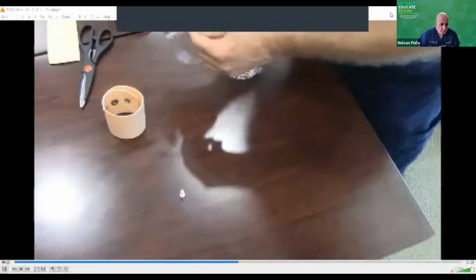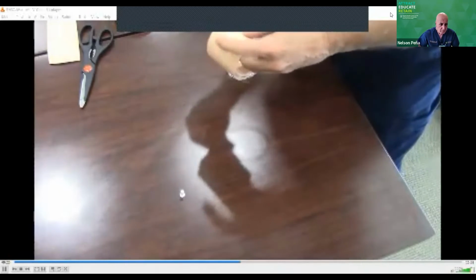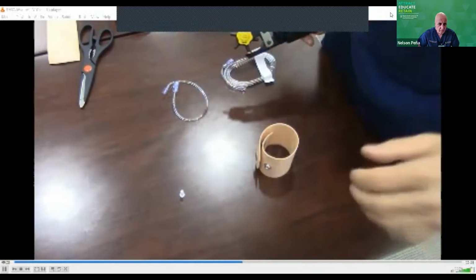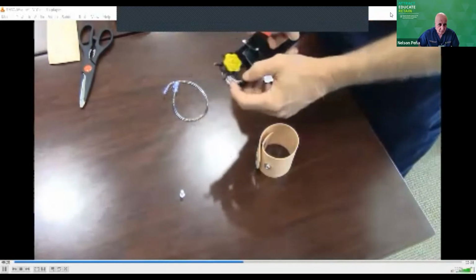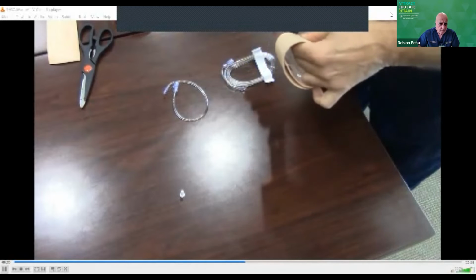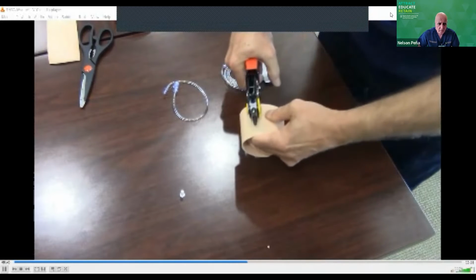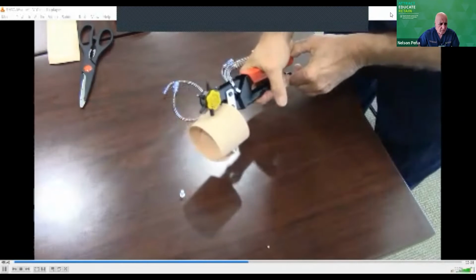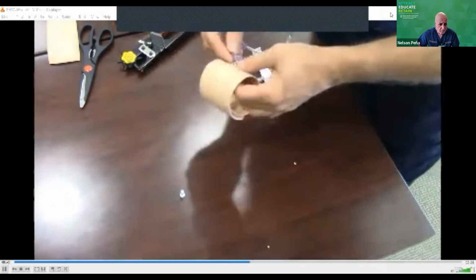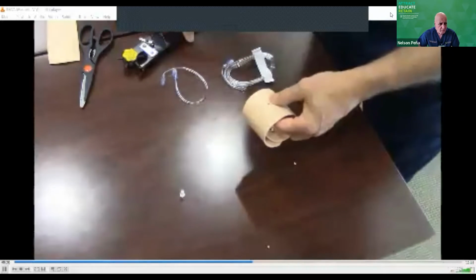So now I need to shove this through this little hole. So I'm going to make that hole a little bigger. Now, because I have this handy little punch pull tool, it's easy for me to go ahead and make the holes bigger. Again, you can do it using a sharp object, a drill, whatever it is that you want to do. You want to make it big enough so you can actually get this piece through here. And that is the challenging part.